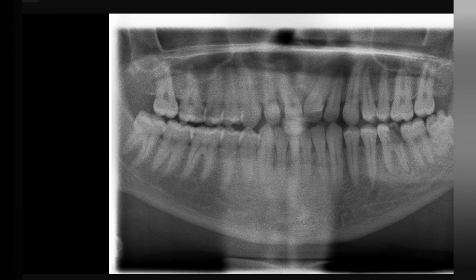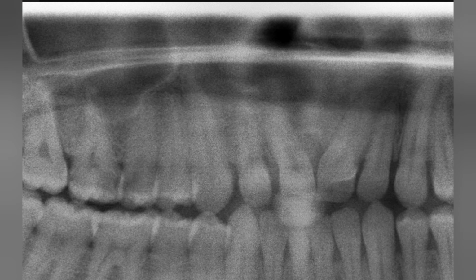Hello everyone, I'm Dr. Vallabh Chawla and today we'll be doing a case report on periapical cystic lesion in the upper anterior region with a history of trauma. So basically, the patient came with the chief complaint of swelling in the upper anterior region.